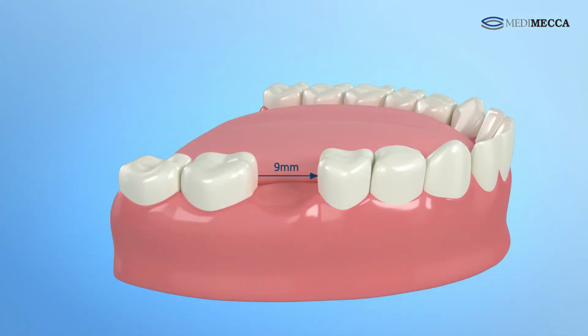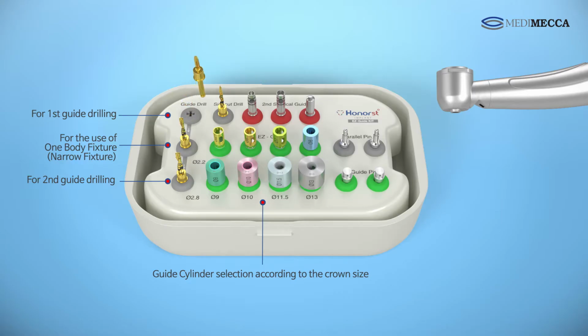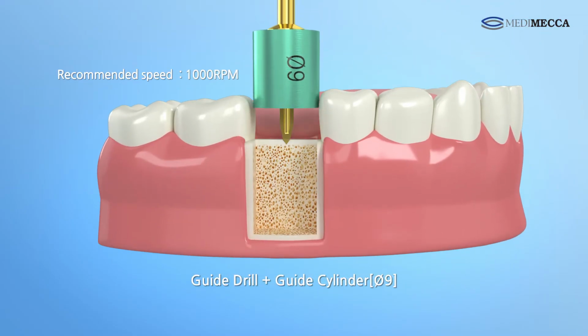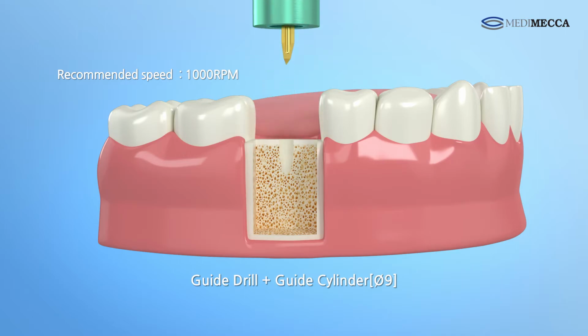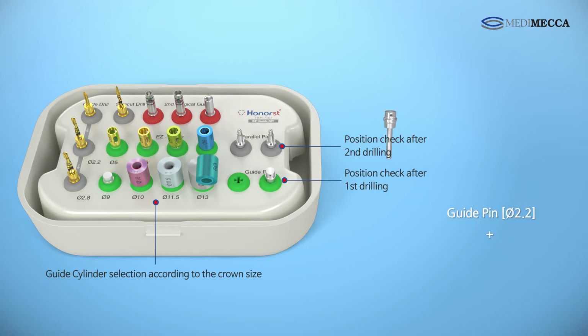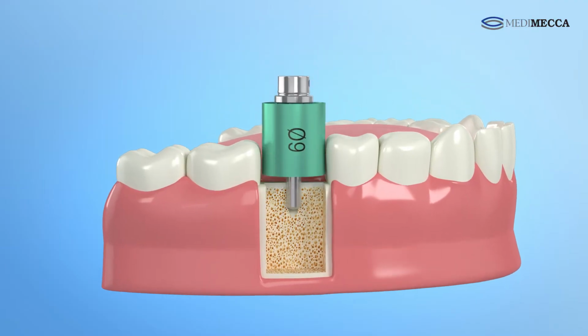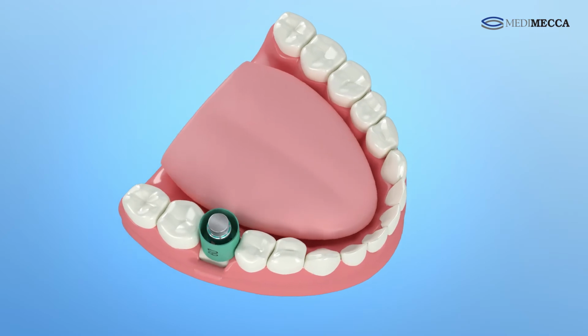Measure the size of the missing tooth. Connect the guide cylinder that matches the size of the missing tooth to the guide drill. Drill below 1000 RPMs. Connect the guide cylinder used for the guide drill to the guide pin. After inserting the guide pin, check the position and angle.